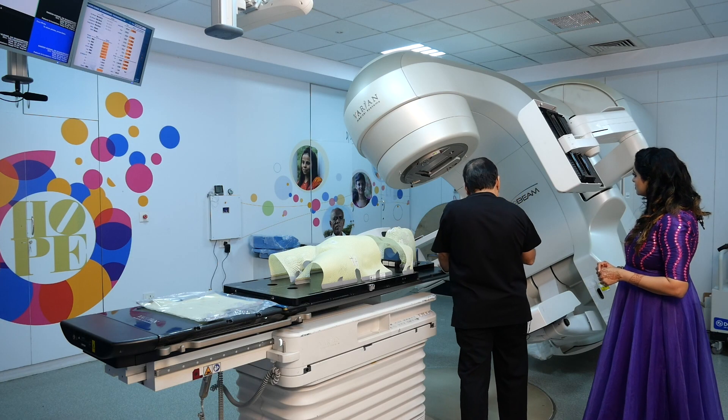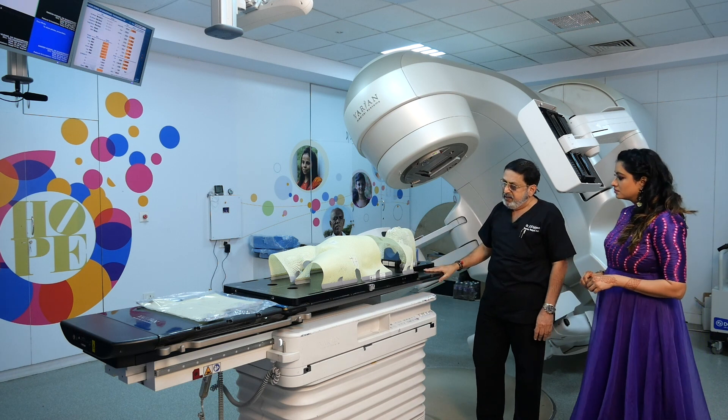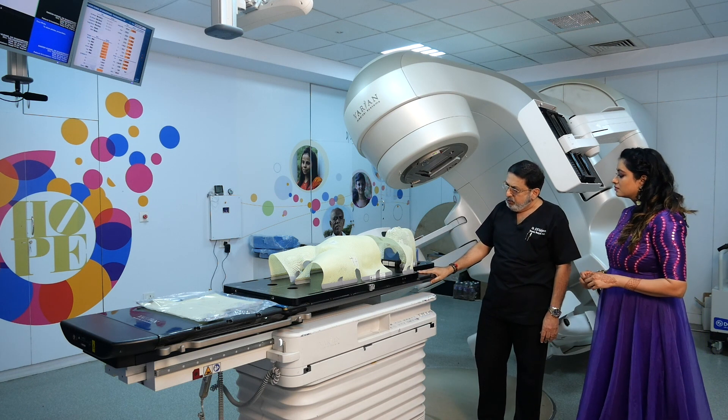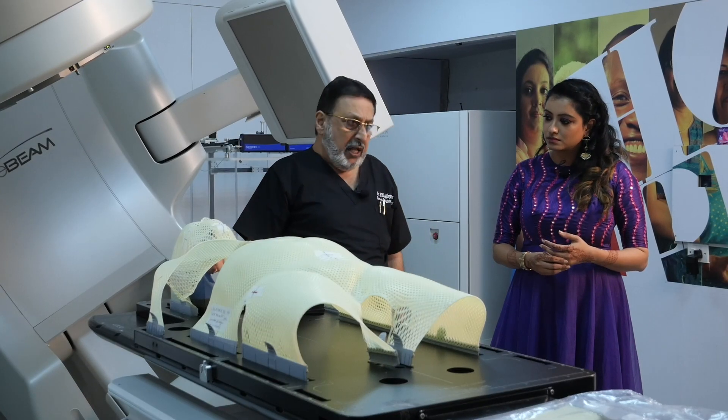The idea is that when you treat the patient, who is on the couch — this is a 6T couch we have, which is a carbon fiber couch — what we do is we immobilize the patient with this kind of a thermoplast.